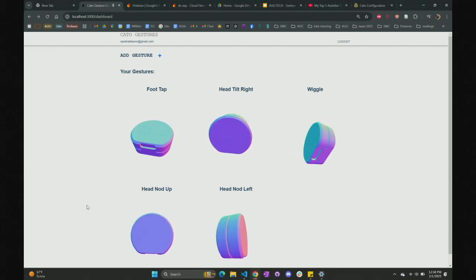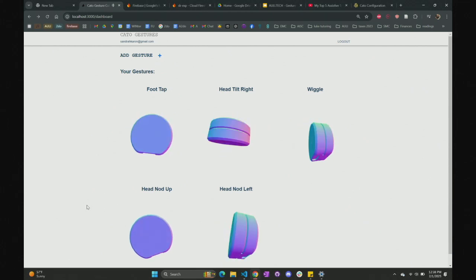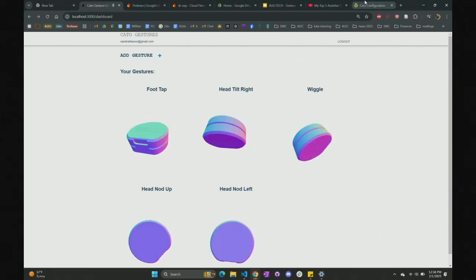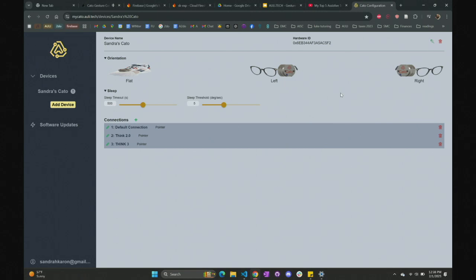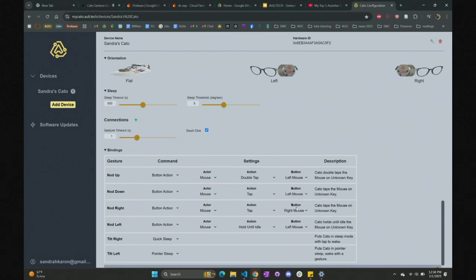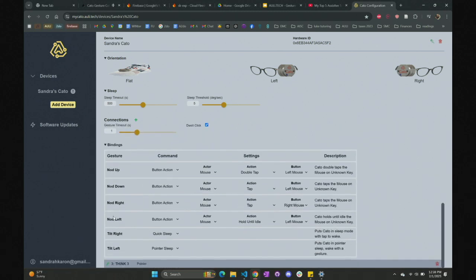That's part of it. That's collecting the actual gestures. But we also need to configure it so that the gestures themselves map to specific outputs on our device. And for that, for any of you that have already used the Cato device, we have the My Cato page. Now, here, we can configure a lot of the things that Alan was talking about, like the sensitivity of the Cato, the dynamic acceleration, things like that. But I want to draw your attention to the actual gesture mouse. These are the gestures that the Cato is currently capable of, and we can pair it with certain actions.